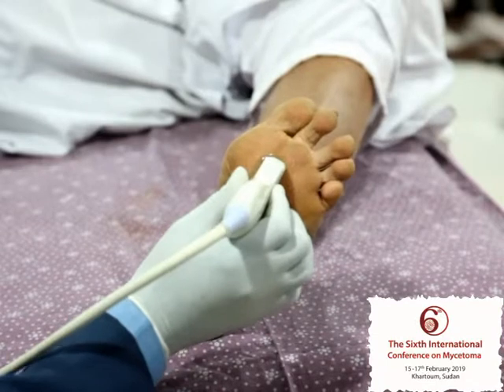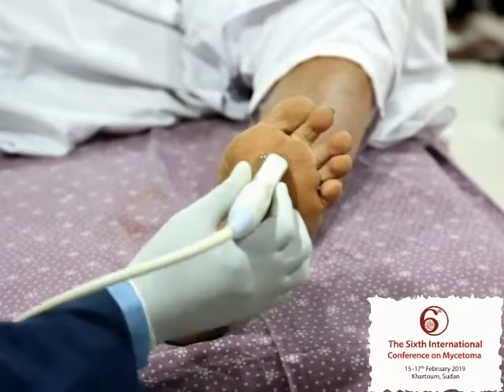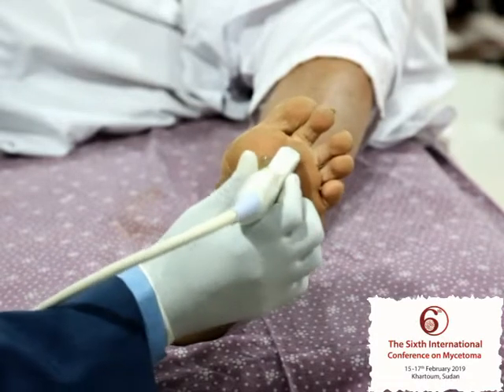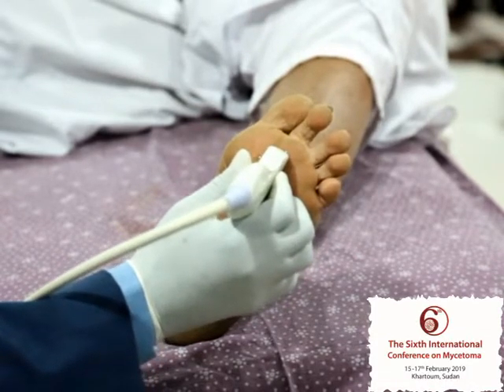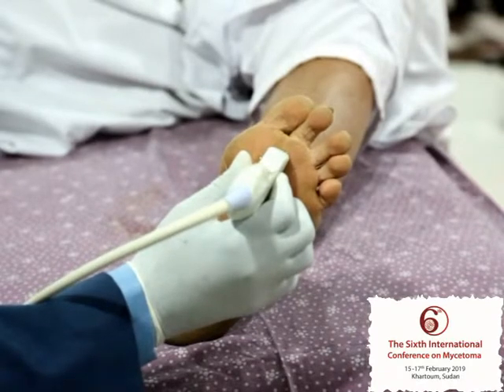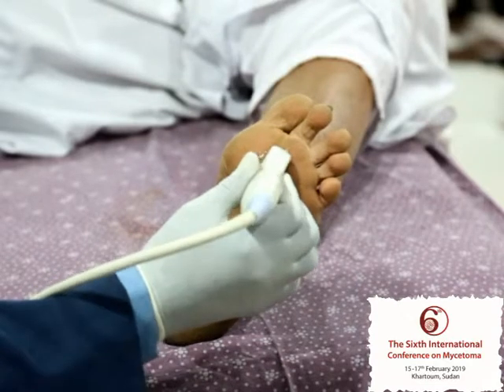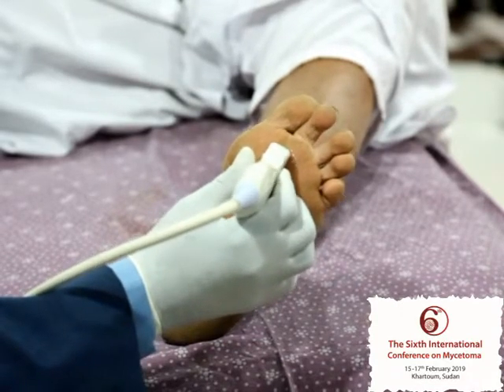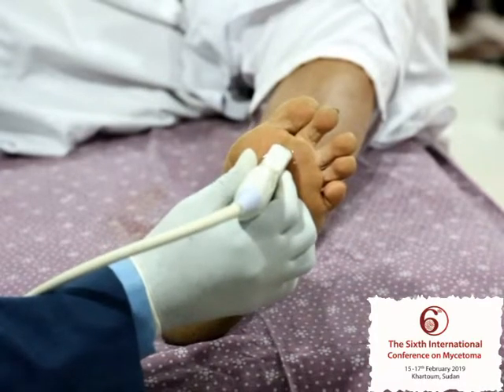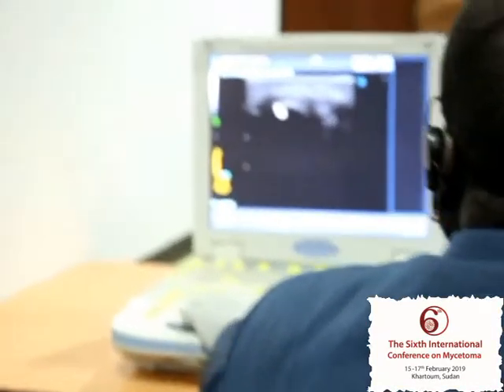Okay, this is the normal anatomy that we can see here. Of course, this is the skin, this very hypoechoic layer, which is a black one. This is the subcutaneous area and the fascia of the foot. And here we have the tendons, this is a tendon, this black structure. And here we have a bone.